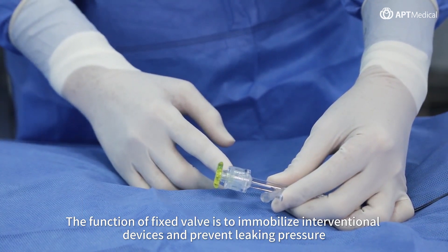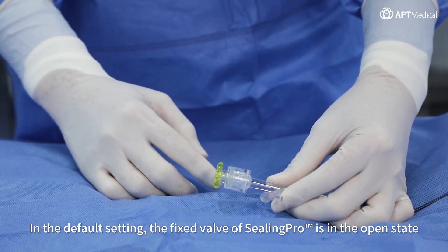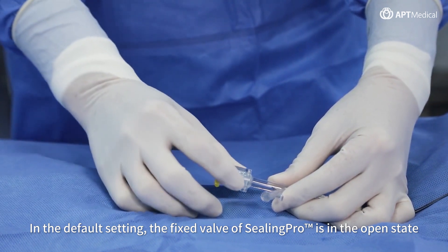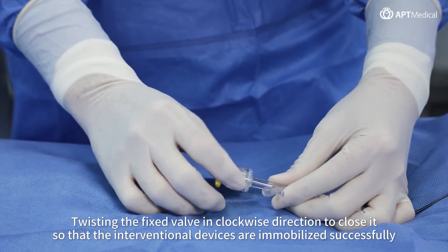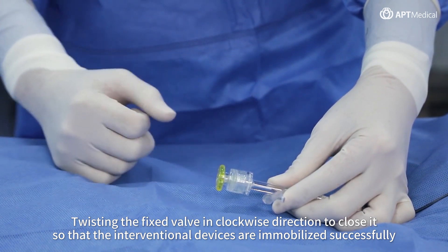The function of the fixed valve is to immobilize interventional devices and prevent leaking pressure. In the default setting, the fixed valve of CeilingPro is in the open state. Twist the fixed valve in a clockwise direction to close it so that the interventional devices are immobilized successfully.